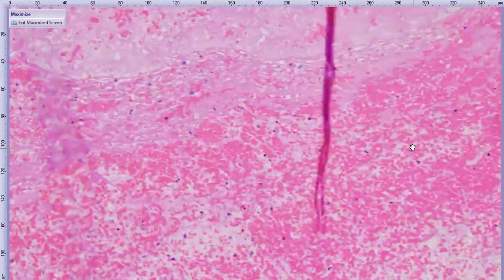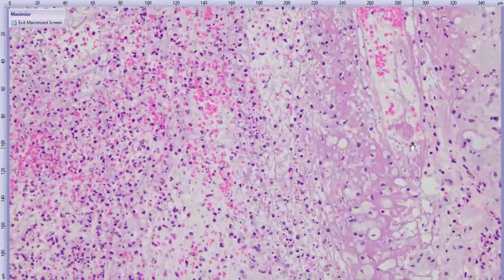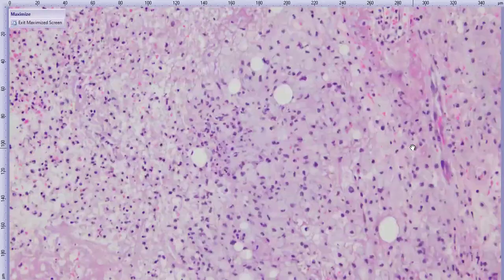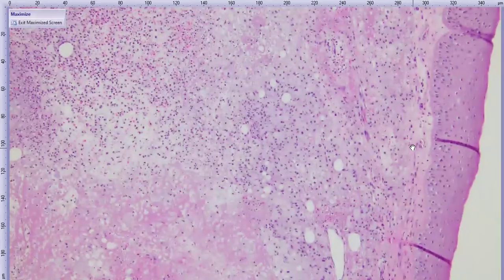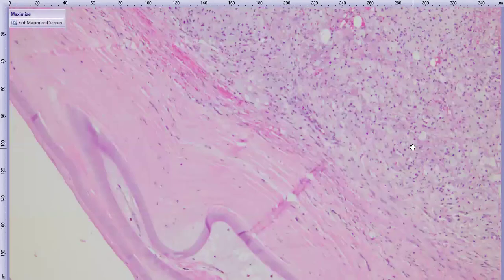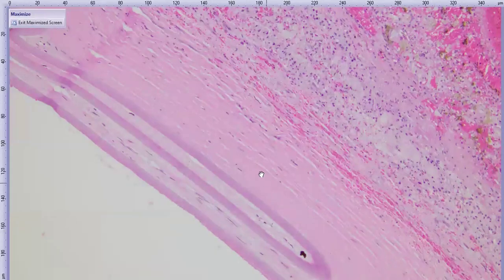And then moving over to these areas of necrosis and hemorrhage, and then kind of flanking these areas of necrosis somewhere, there's areas with neutrophils. But the majority of this infiltrate is this granulomatous or lipogranulomatous, if you will, inflammation. And then we can drop down to the deep corneal stroma where it is relatively normal. There is some vascularization, but I think we have a good reason for that. Otherwise, yeah, we can see the nice normal lamellar arrangement of the stromal collagen.